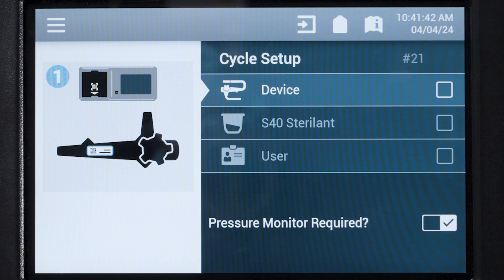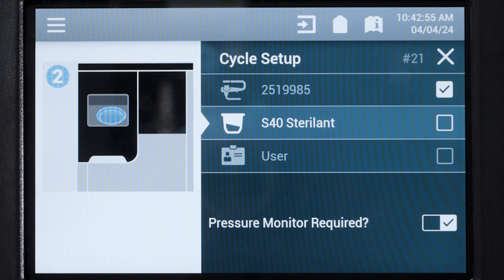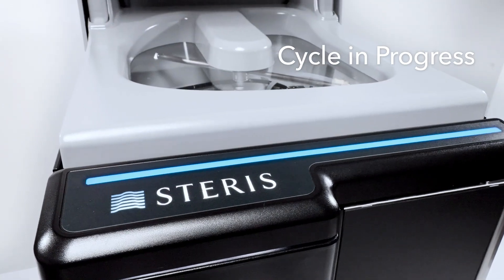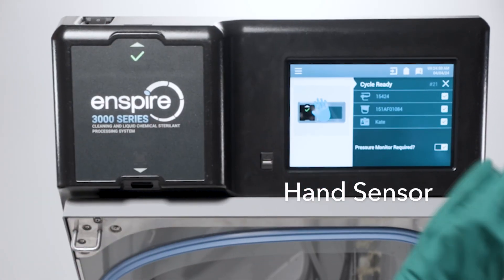Say hello to easy integrated workflow that guides you every step of the way — intuitive, apparent, minimal touch points.